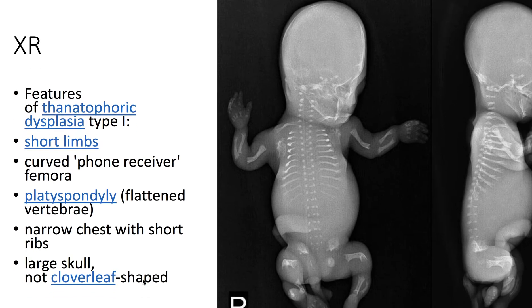On x-ray, we see features of thanatophoric dysplasia type 1: short limbs, curved phone-receiver femora, platyspondylae or flattened vertebrae, a narrow chest with short ribs, and a large skull — not cloverleaf shaped.